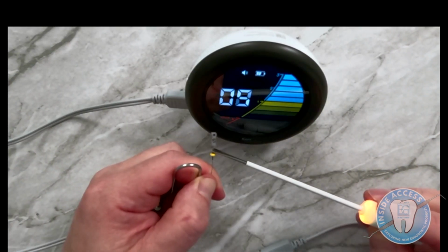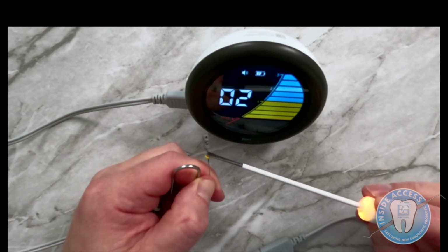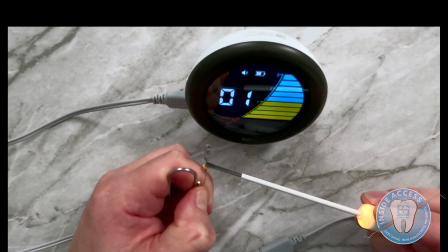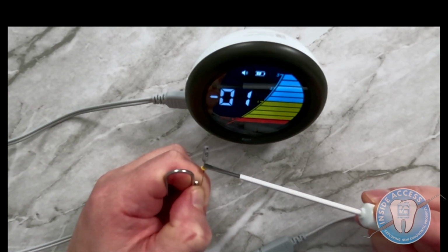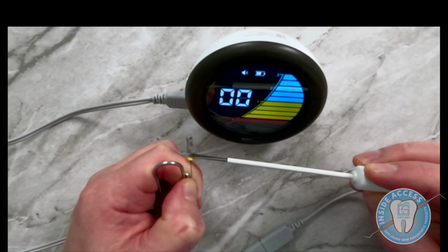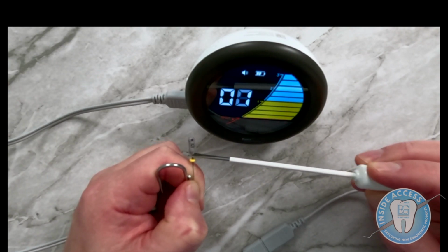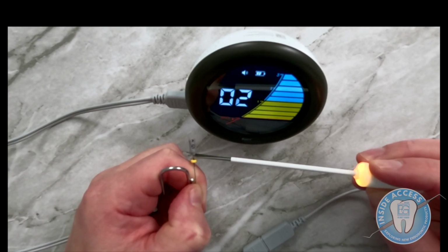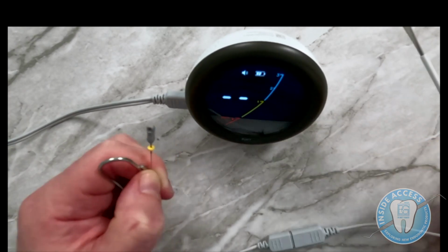Okay, and the same functionality occurs with the file probe. As you see how it lights up, and as I progress down into the canal, it'll light up red, indicating apex. And then when I back it out, you can see how it'll light up yellow, letting me know that I'm back in the range of apex location, right, getting back to that minor constriction, wherever you'd like it to be.